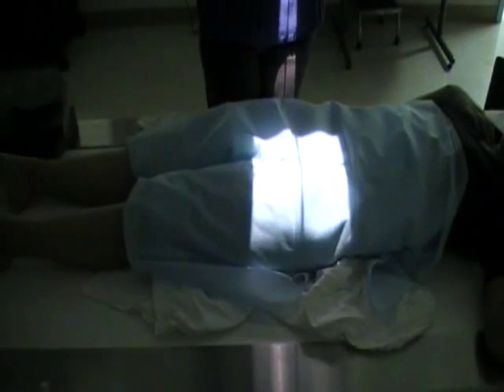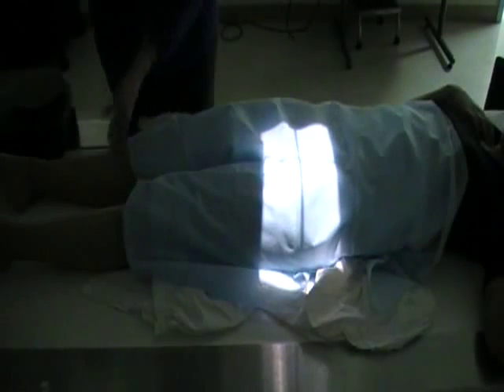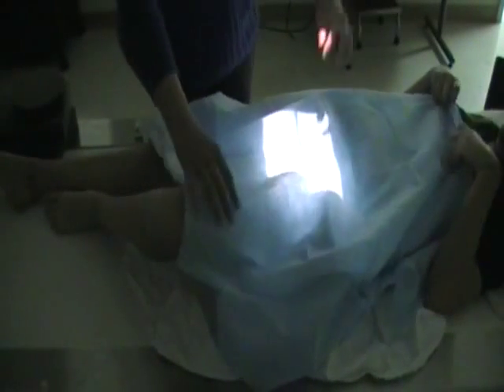Next is the frog leg lateral, the modified Cleaves. Now to do this, you can put your cassette in crosswise because the length of the femur is going to be heading out transverse. So you can change your 10 by 12 so that it is going in crosswise. Then bend the knee of the patient up, and then let the leg fall out at approximately a 45-degree angle. And again, that's where you get the frog leg term, because it looks like frog legs.